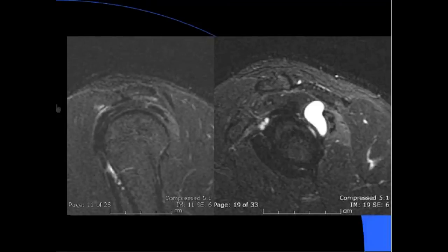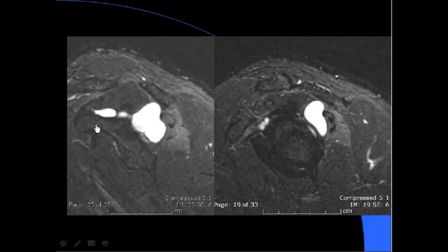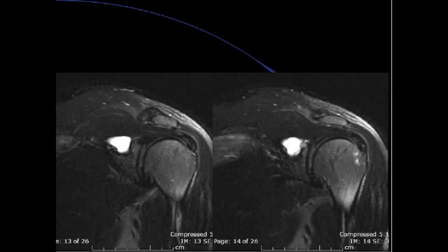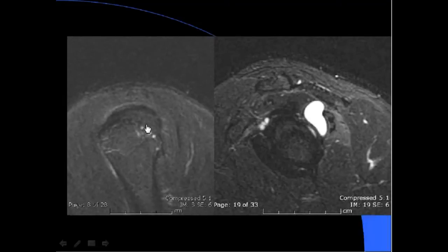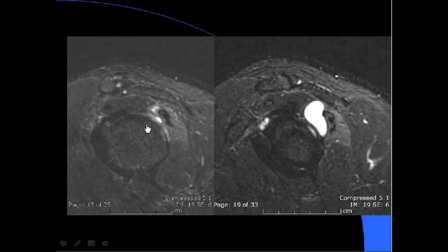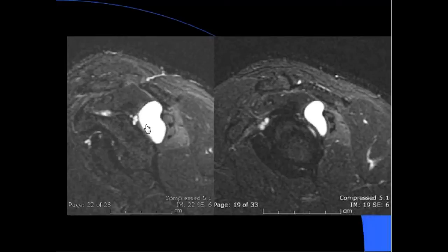There is a paralabral cyst in the spinoglenoid notch. Here is the anterior border of the glenoid, posteriorly is the supraspinatus and infraspinatus. The cyst is here, and there is edema in the infraspinatus muscle. Look at the low signal of the rest of the muscles compared to the infraspinatus. More anteriorly is the suprascapular notch.